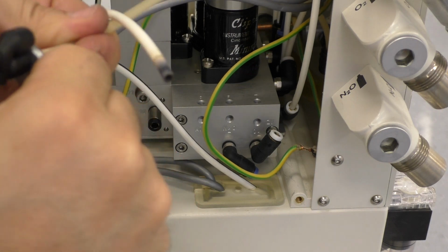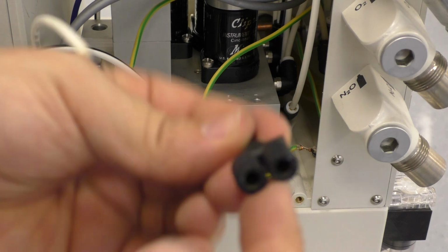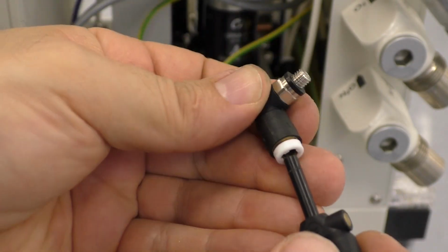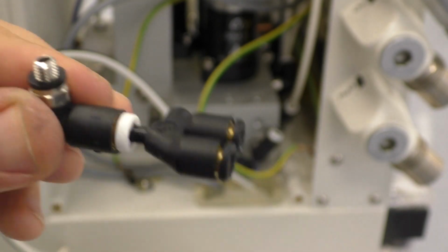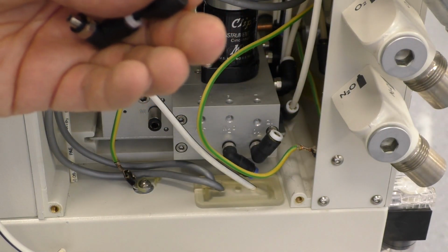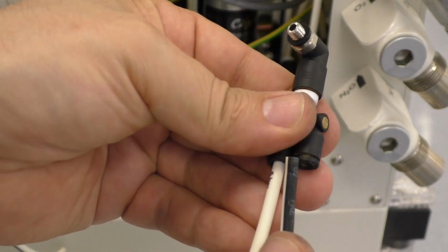Ooh, it's getting black there. For example, a two in one piece, which fits perfectly into the next piece, like this. Then you have a connection for two hoses. For example, like this and like that. You screw it on.